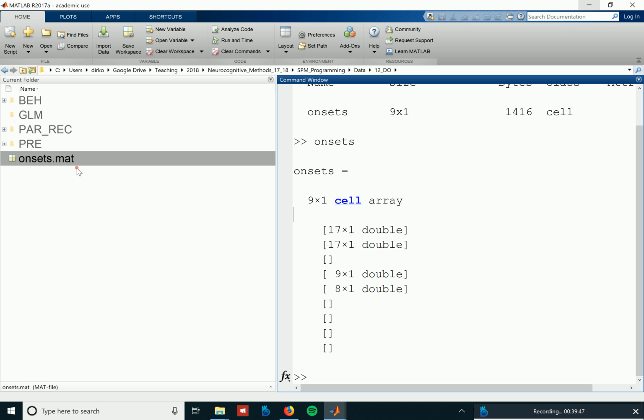So, but this is of course only for a single session. So somewhere in the files there was a conversion of the original stuff that was saved into these onsets, although I think I actually saved also this thing as that.